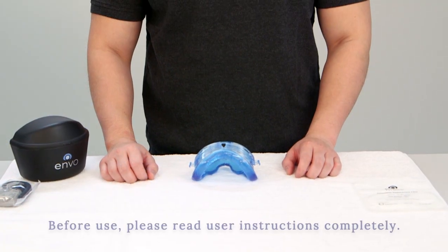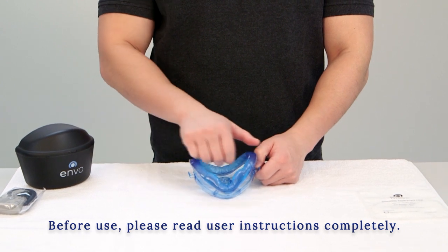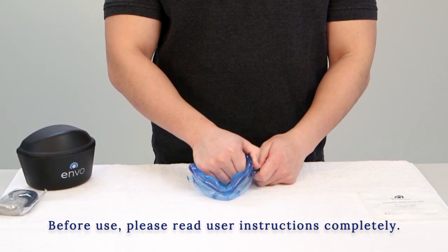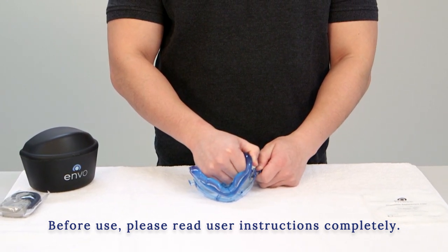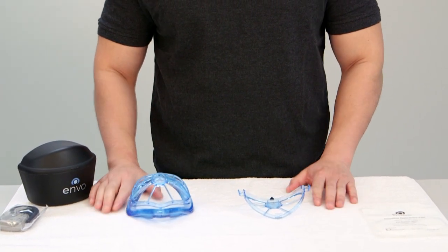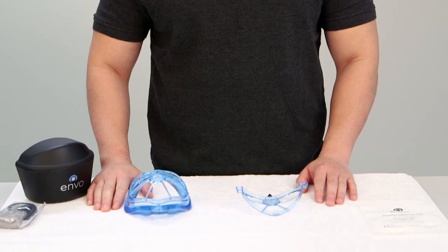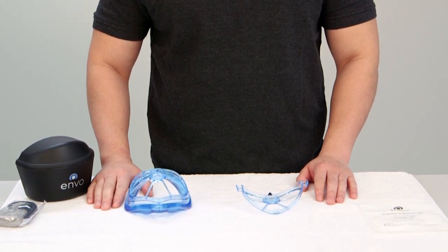To separate the filter cover from the mask, place the mask filter cover side down. Insert one thumb behind the headgear tab and your other thumb on the mask body. Pull the headgear tab away from the center of the mask body, removing the filter cover on the first side. Once one side is released, the rest of the filter cover can be removed easily.